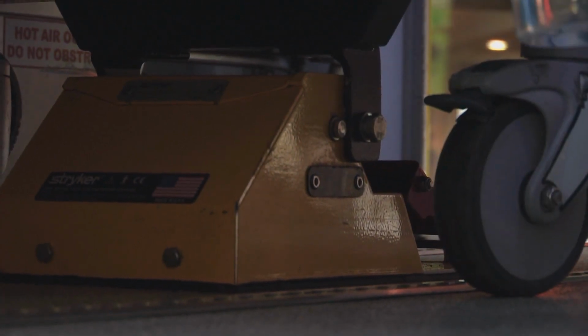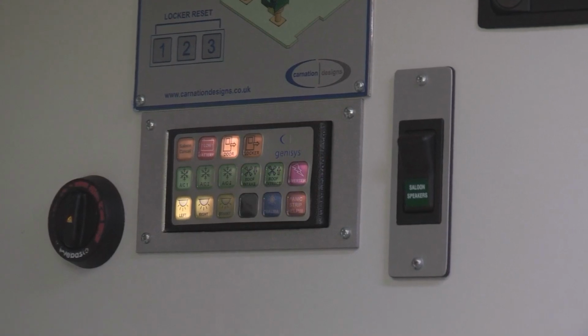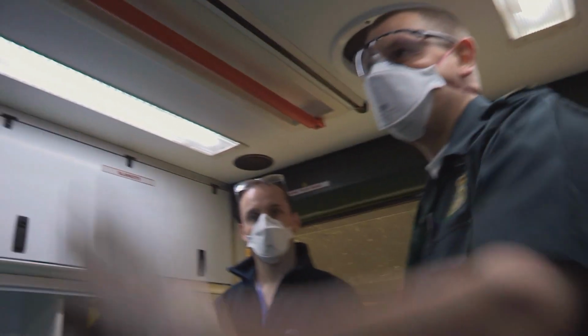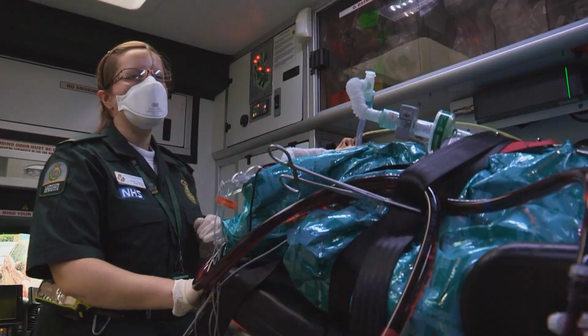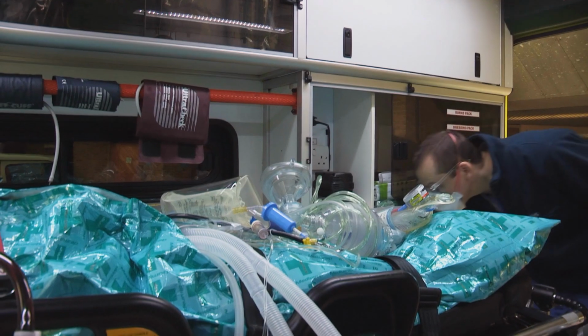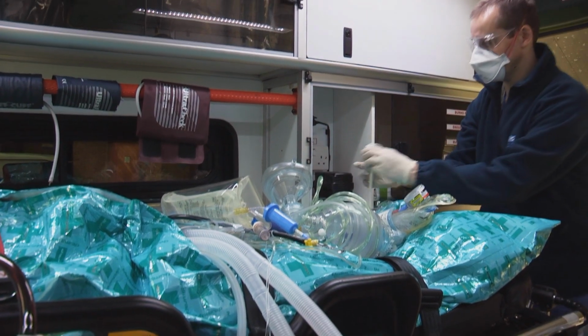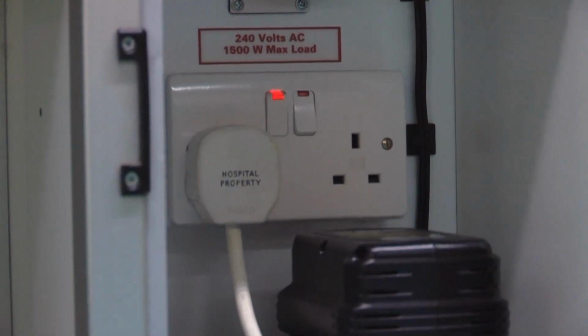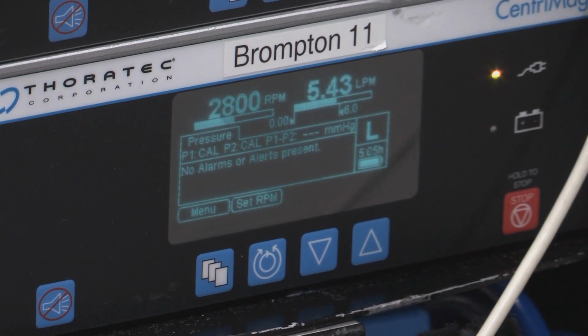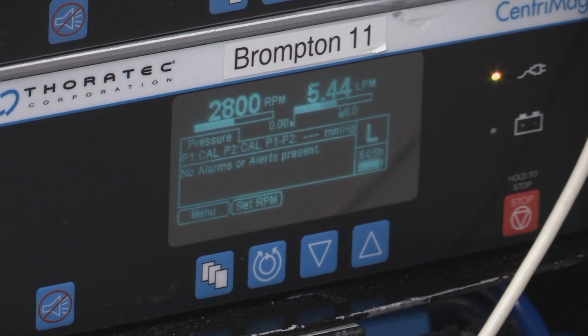The electrical equipment on the trolley needs to be plugged into the ambulance mains inverter. So, Alison, can you turn the inverter on, please? One of the crew should press the inverter button located in the saloon electrical control panel. Ensure that the socket being used is switched on and receiving power. Okay, power on. This should be supervised by the team leader and confirmed out loud.